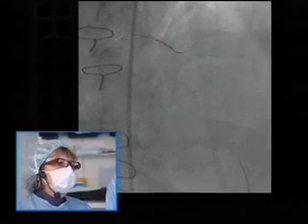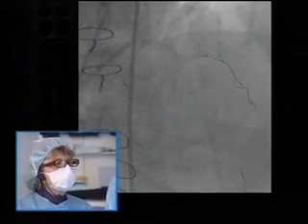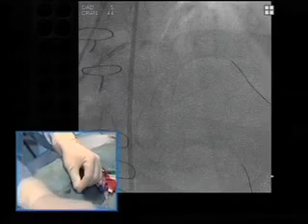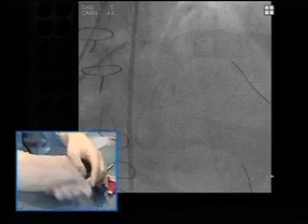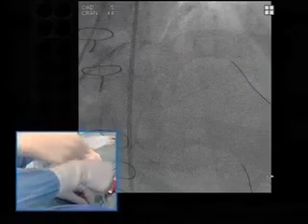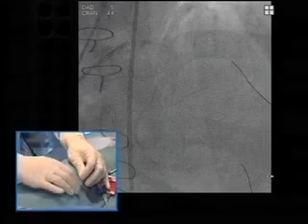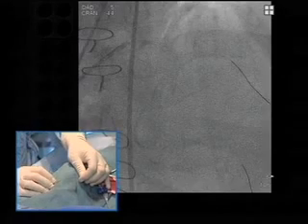Well, provisional stenting approach is certainly fine. The question is how. If you are going to just do the balloon angioplasty, what I would probably recommend is to use a cutting type balloon angioplasty to expand the lesion better. What do you think? I think, with the calcification in the main vessel and also the ostium of the side branch, pre-treatment with the cutting balloon would be a good idea also. But I don't think you can get away with provisional stenting.